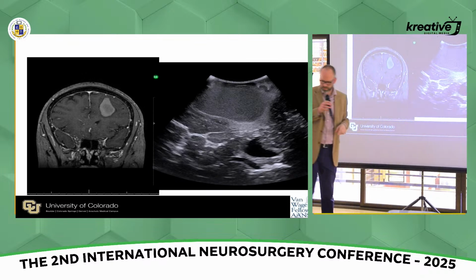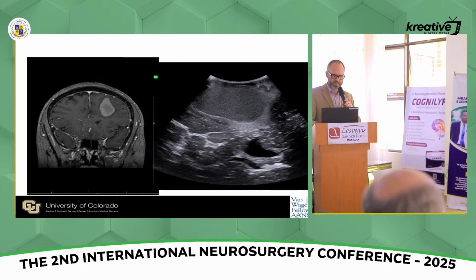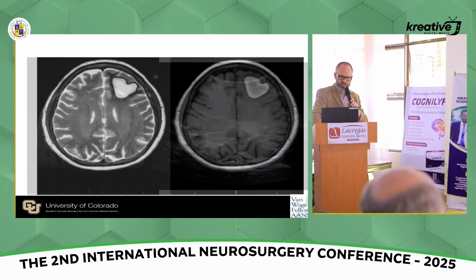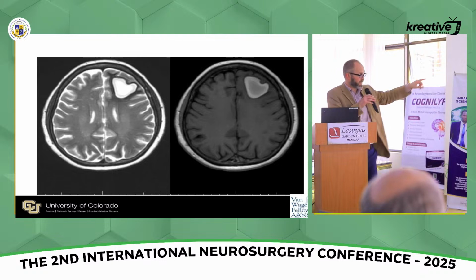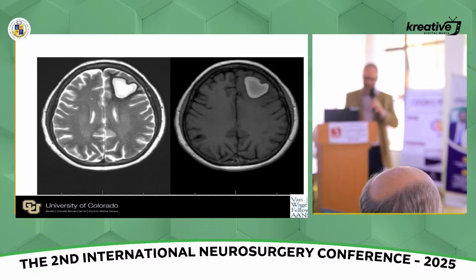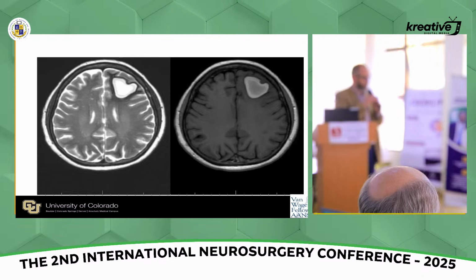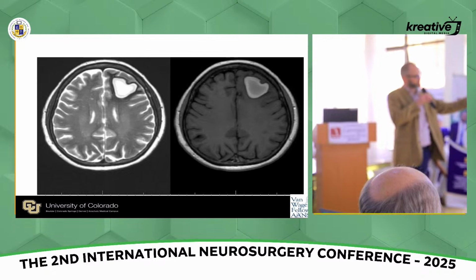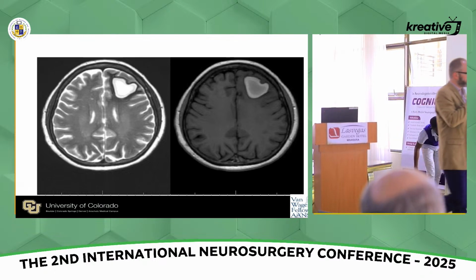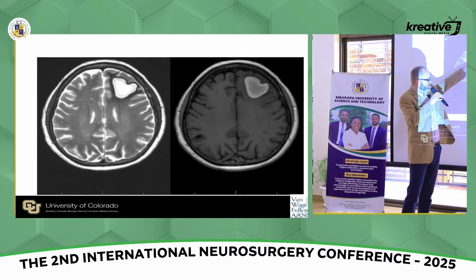So ultrasound was very useful here, in that the capsule of the tumor was actually better visualized on ultrasound than it was on MRI, because there had been a little prior bleeding, and the MRI showed some of the hemosiderin and didn't clearly depict the capsule exactly well. But here is post-resection now. This is now flipped the other direction, but you can again appreciate that the compressed lateral ventricle has now been nicely decompressed by resection of the tumor.